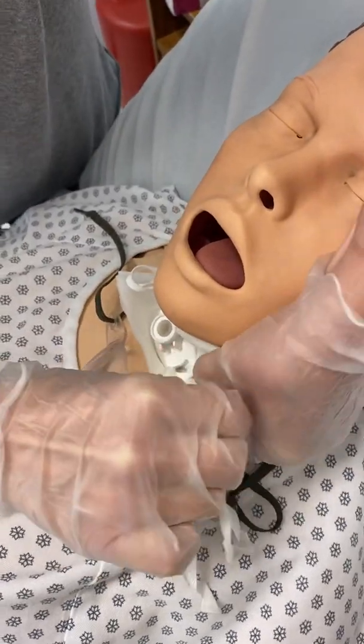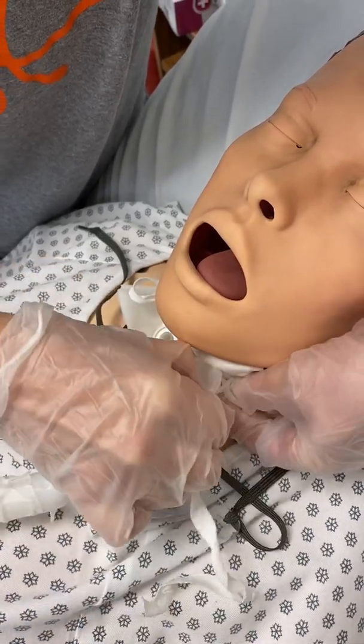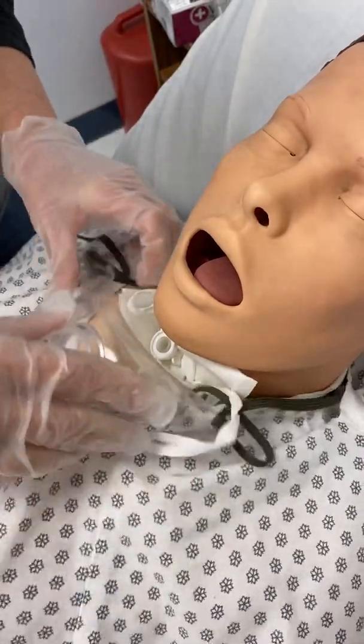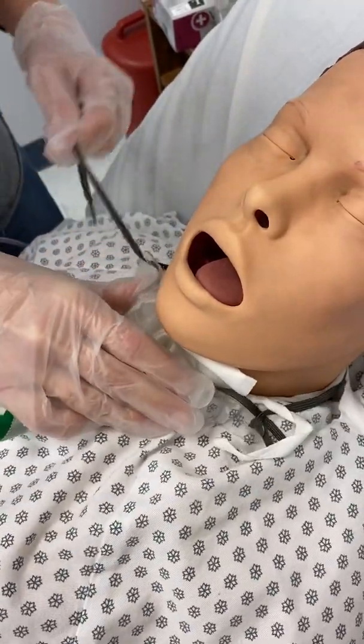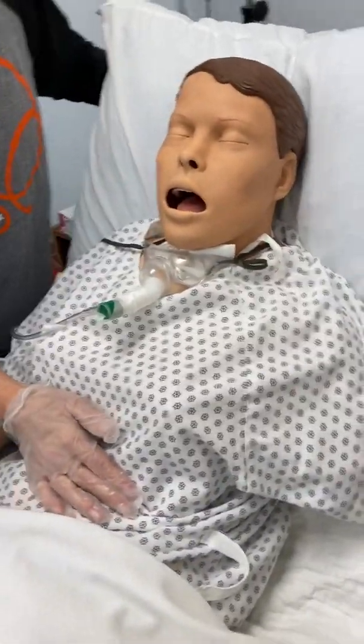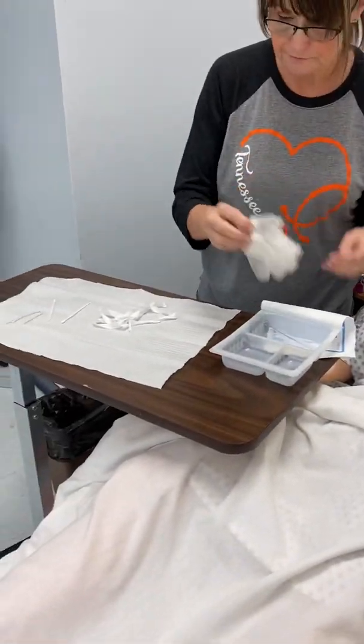You do need to practice doing this with gloves on. It does make it a little harder. As you can see, my gloves are big and it's making it harder for me. Okay, so it's on. Put their oxygen back on them. Are you doing all right, sir? Okay, we're going to pick his end of the bed up. Going to take my gloves off.